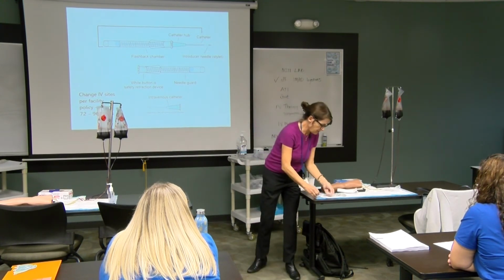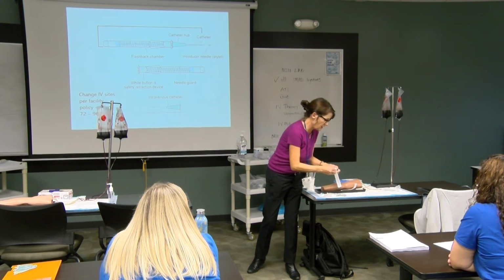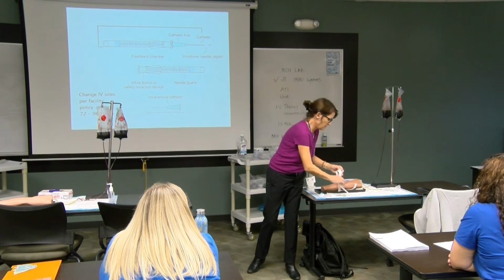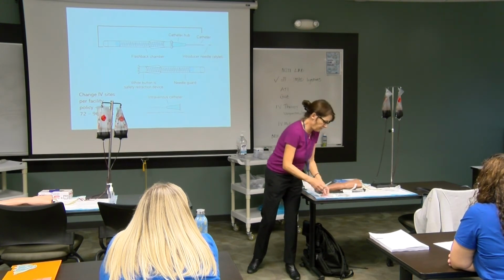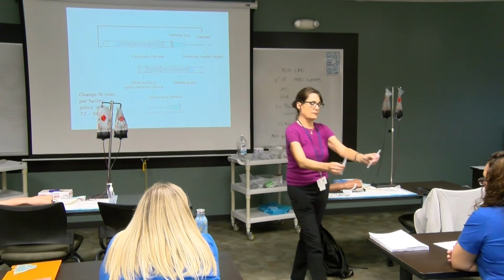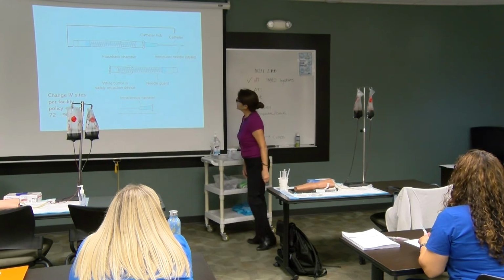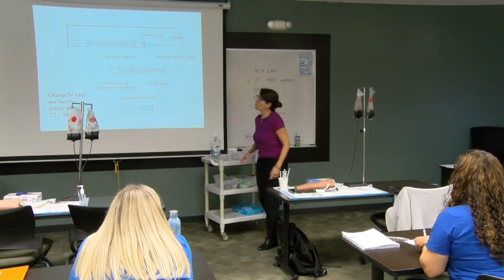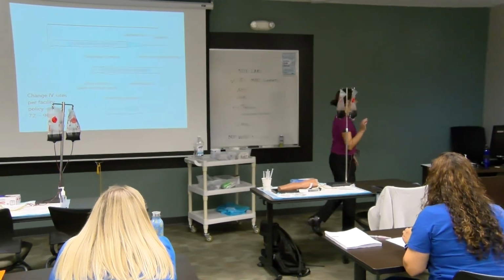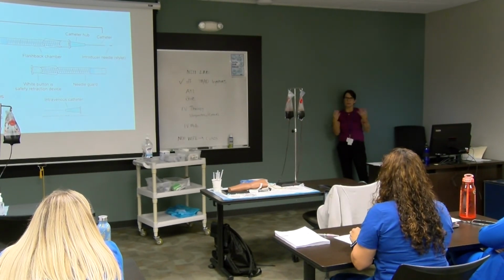Now, I'm going to pass around a couple of these catheters right now so you can take a look. The pink is the 20 and the blue is the 22 gauge. If you want to take a look. Yeah, the white button on these, don't press that right now. That is the safety guard, and the needle will retract, so we can't reuse it.